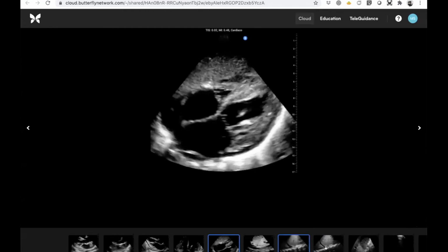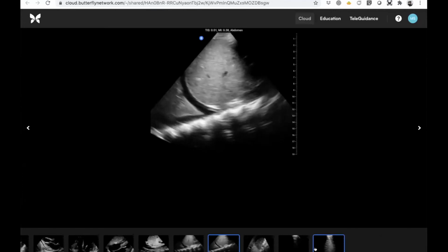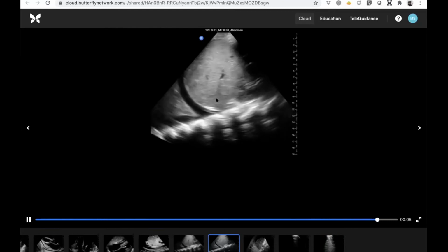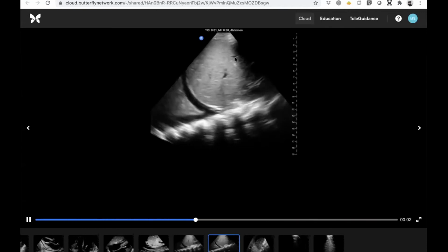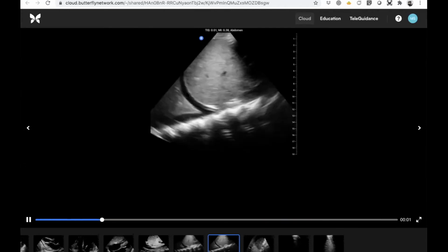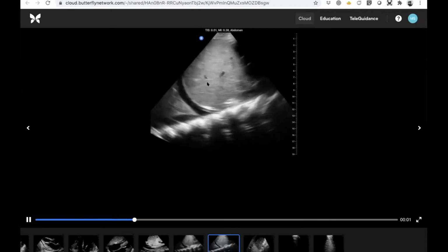Yeah. So you can tell even off the thumbnails what we're looking at down here. So this one, this is a great image, and I'm going to have you explain the spine sign. I'll point out the anatomy first and then talk about what this means. So, this is a coronal view. So the probe is over on the right flank. This is liver, diaphragm here, this curved structure. We've got a little bit of the upper aspect of the kidney.